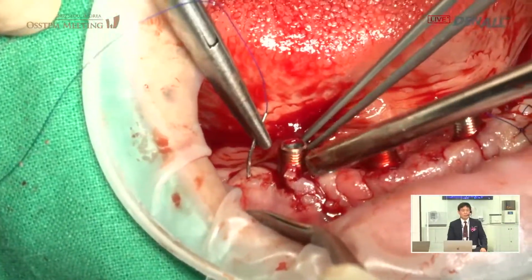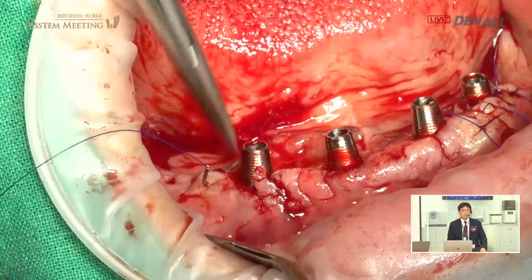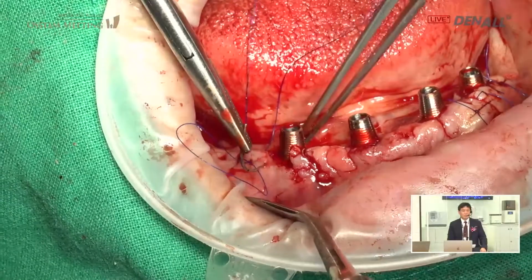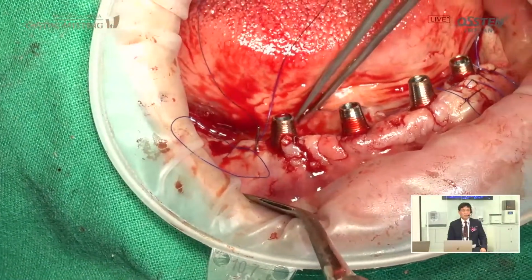Osstem 2022 Live Surgery. The slogan is a little bit easier digital in day-to-day activities.